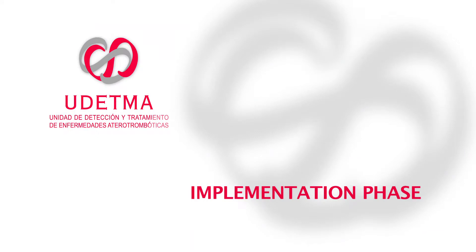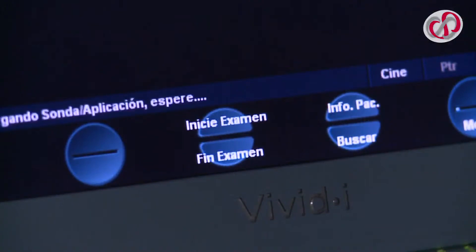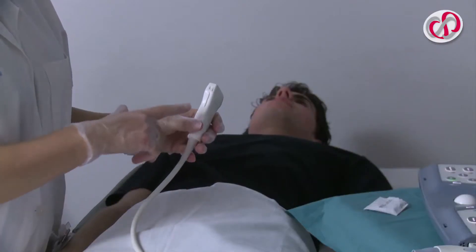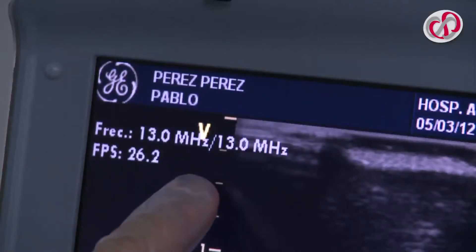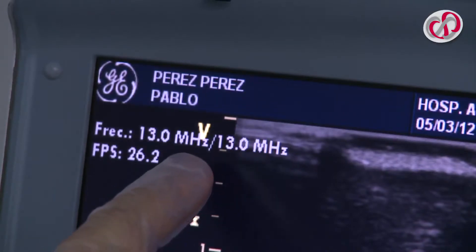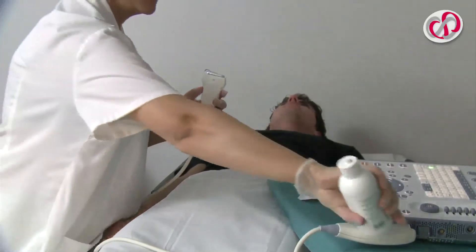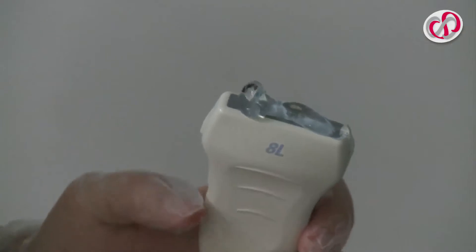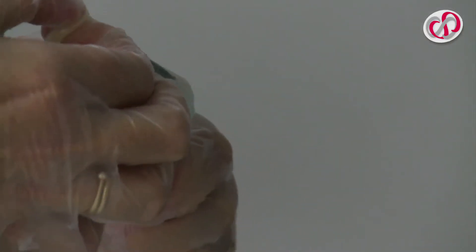Implementation Phase – The test begins. The notch on the ultrasound corresponds to the V of the screen that indicates the orientation of the image. The conducting gel is placed on the surface of the probe and then the protector is attached.